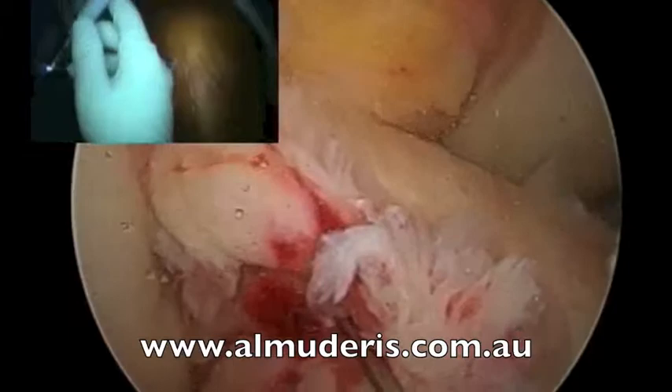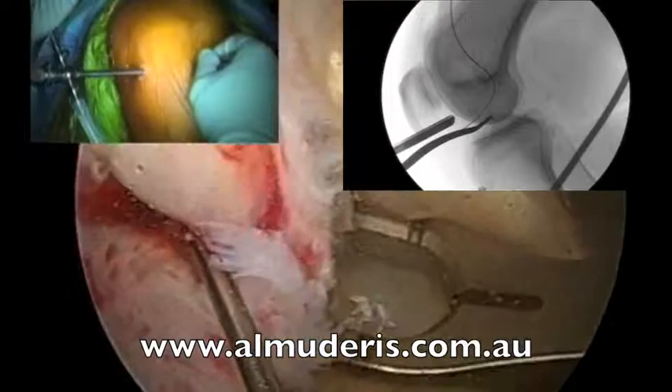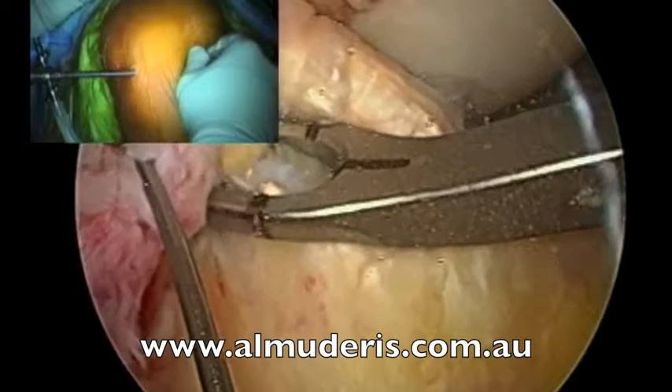Now we swap the camera again and proceed to the tibial component. As you can see, the footprint of the tibial jig is sitting on the ACL stump. X-ray. You can see the flip cutter coming out through the footprint, and it keeps coming out.